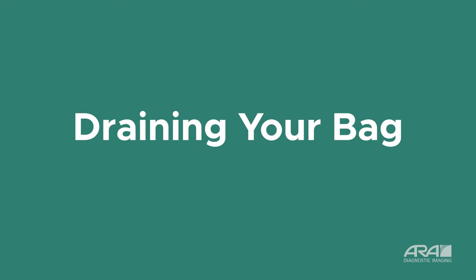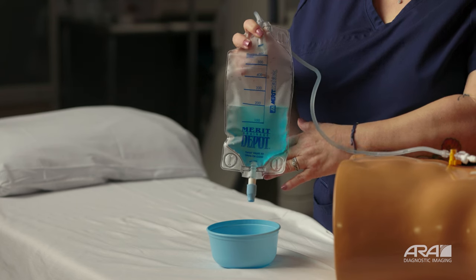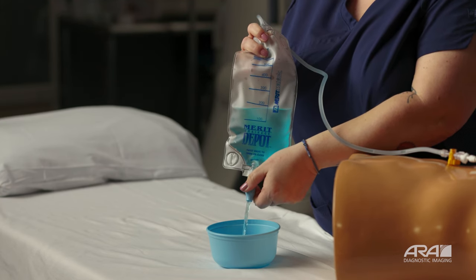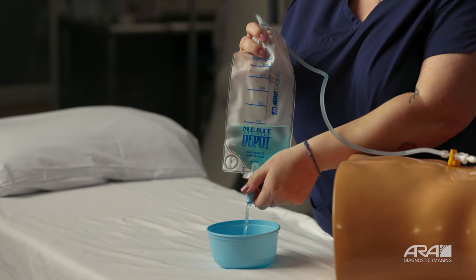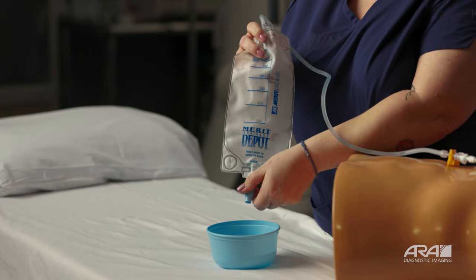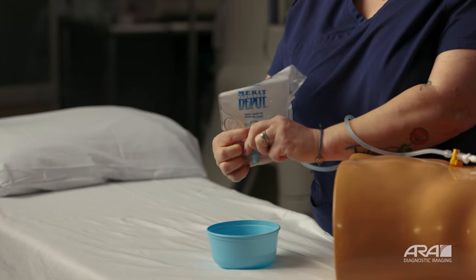After you've recorded your output for the day, you'll want to empty your bag. Go to the bottom of the bag and twist your blue cap until fluid is draining. You can drain this fluid into a bowl or into your toilet. Once your bag is completely empty, twist your blue cap in the opposite direction, which closes your bag.